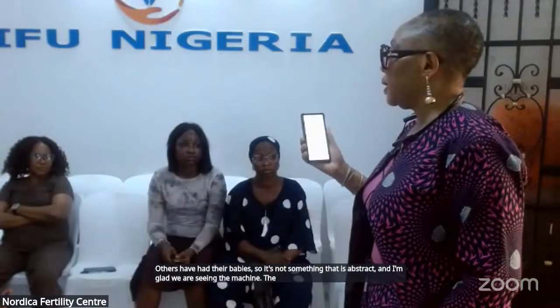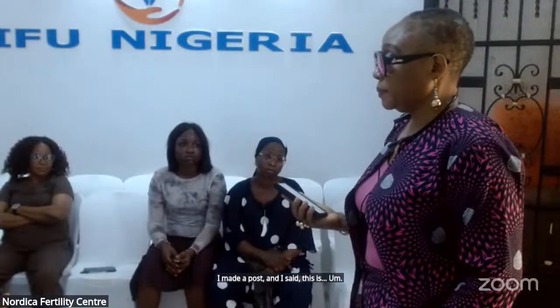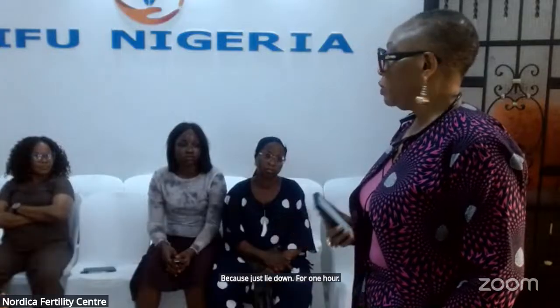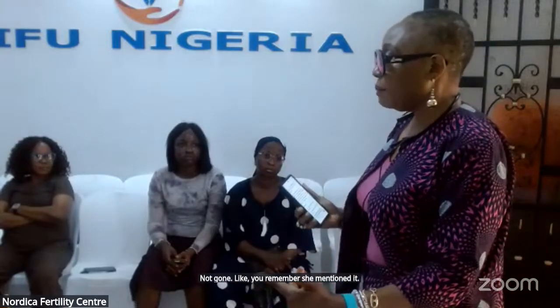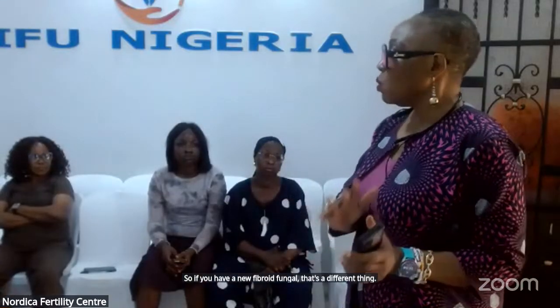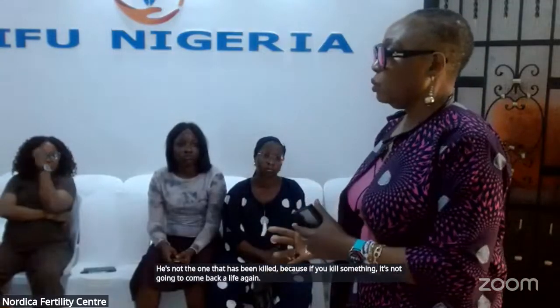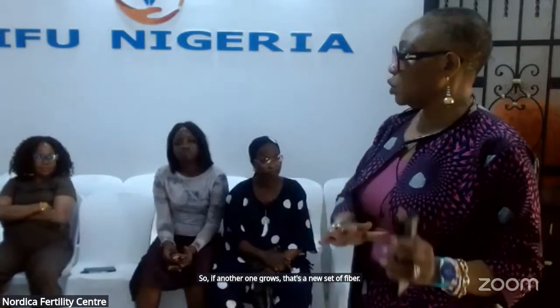The first time I had the opportunity to see the machine live, I made a post and said, this is a wonder, because you just lie down for 1 hour plus, and your fibroid is technically gone. Not gone, like you remember she mentioned, it's still there, but it's been killed. So if you have a new fibroid growth, that's a different thing. It's not the one that has been killed, because if you kill something, it's not going to come back alive again. If another one grows, that's a new set of fibroid, and that can also be dealt with.